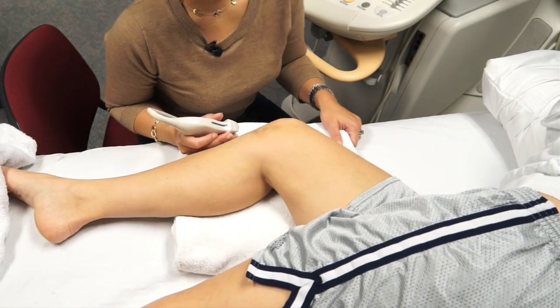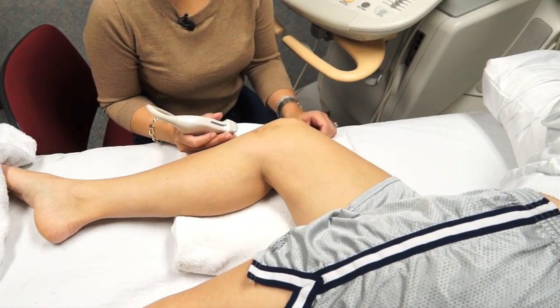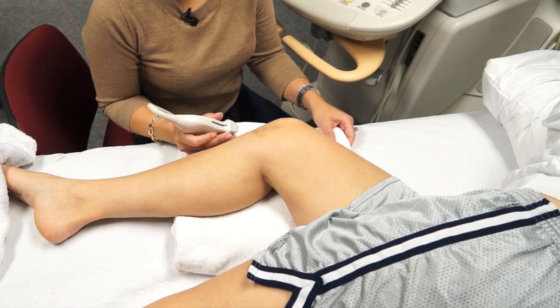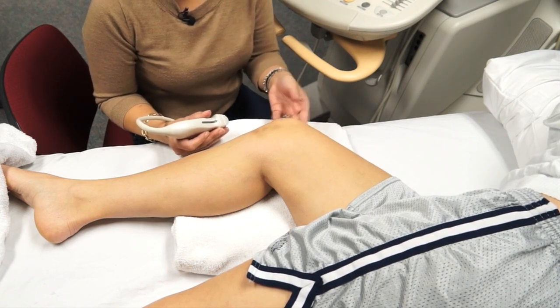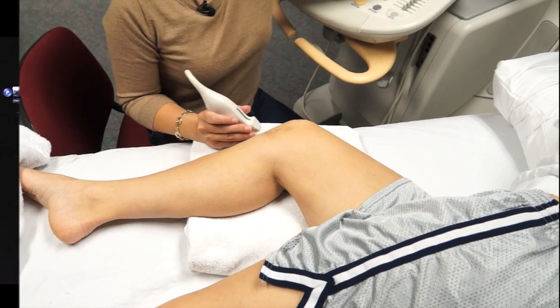Okay, now moving on to the medial knee. You can either have the patient on their side, on the bed or on the stretcher, or you can have a towel rolled up just to prop up the knee. Okay.